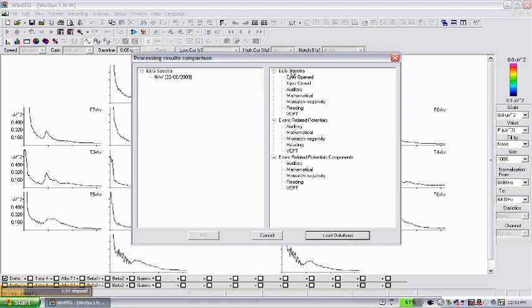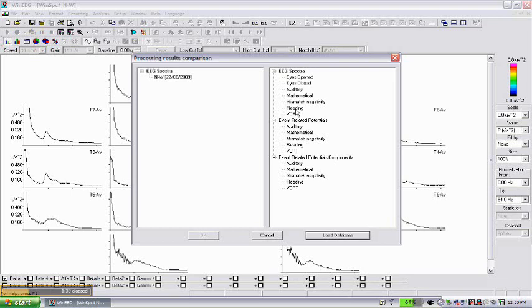On the right in this window you can see different options, each spectra computed for eyes open eyes, closed condition, and five task conditions. Because we compute a spectra for the task, we select the VCPT task and we just click OK.